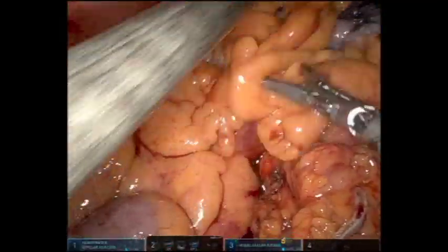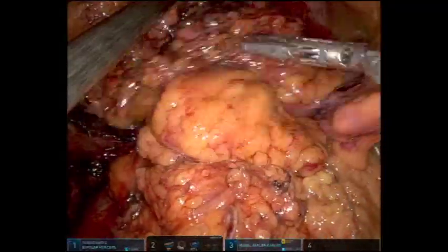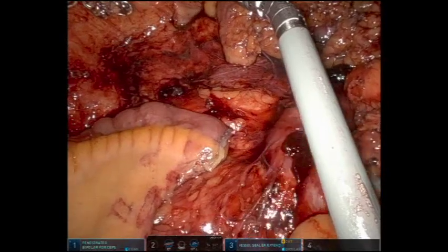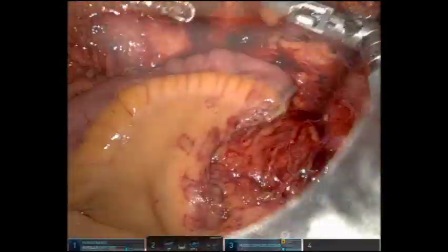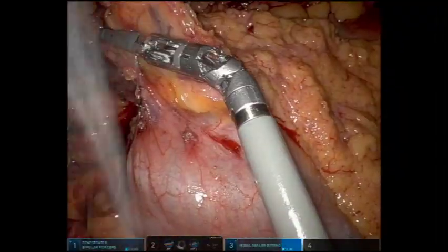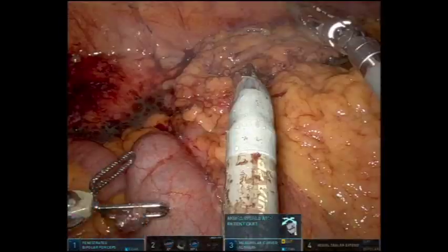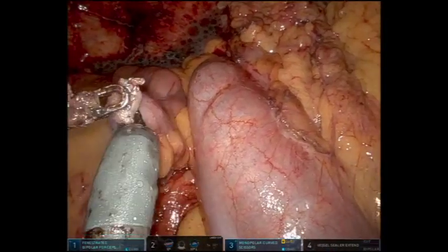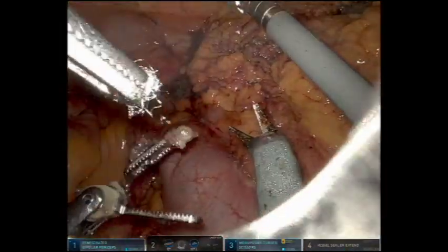The specimen is placed above the liver on the right side. This maneuver clears the area in preparation for formation of the anastomosis and proves that the specimen is completely free of all its attachments. The area is irrigated and no bleeding is seen. Some omental attachments are taken down so that the transverse colon easily reaches the right side. The terminal ileum is aligned with the transverse colon in an isoperistaltic fashion and the anti-mesenteric border of the small bowel is opened.